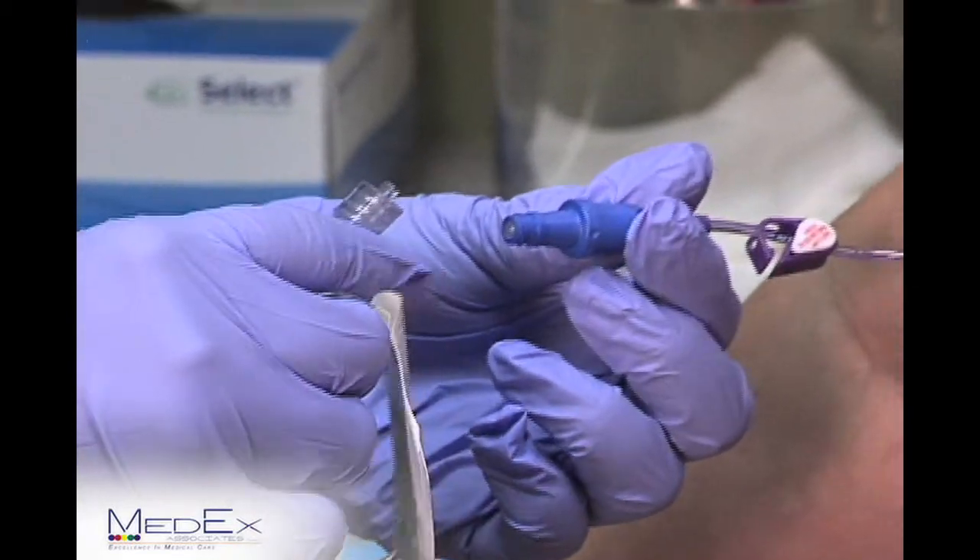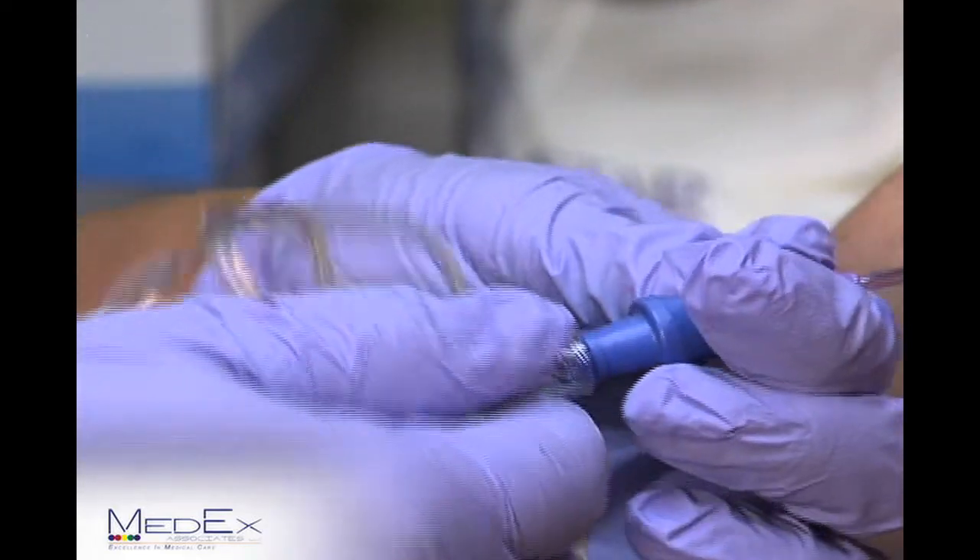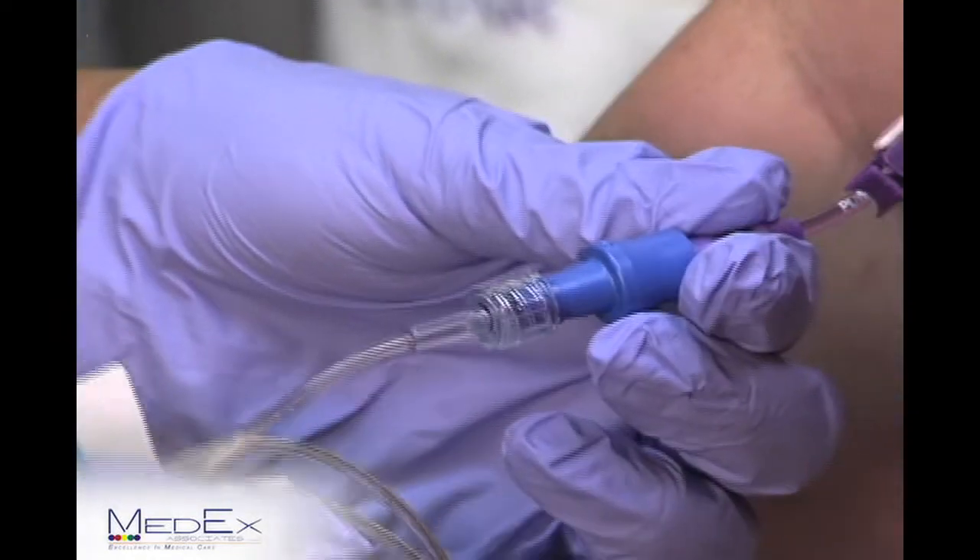You'll hook up your antibiotic by firmly attaching and turning to the right until you see it get a snug fit.